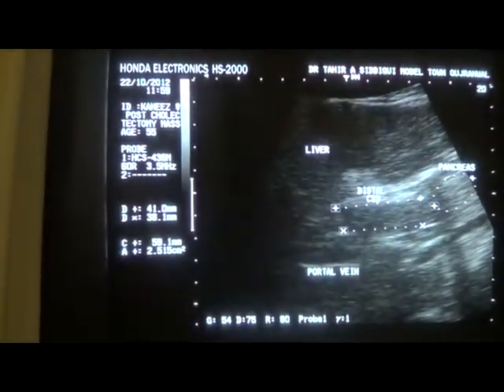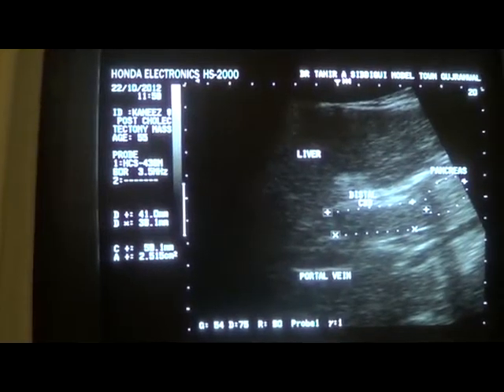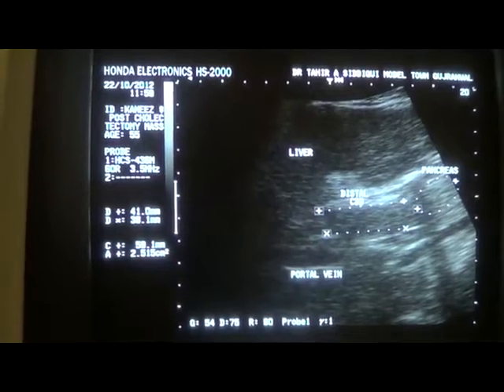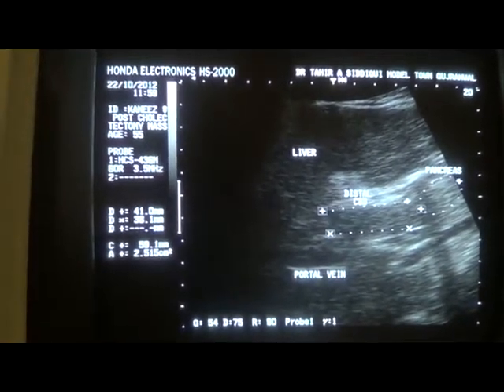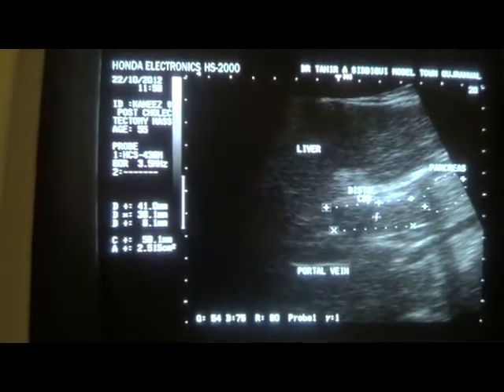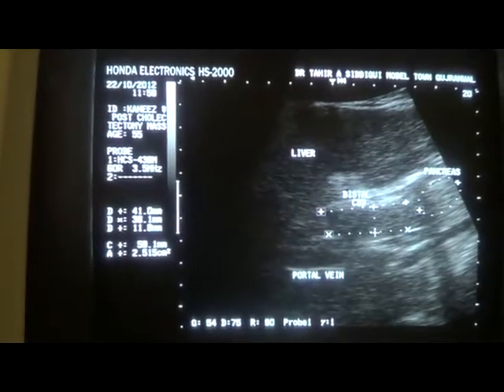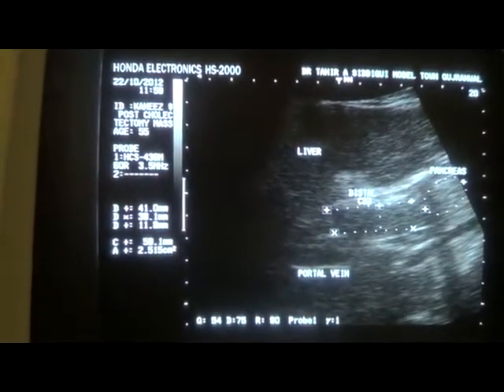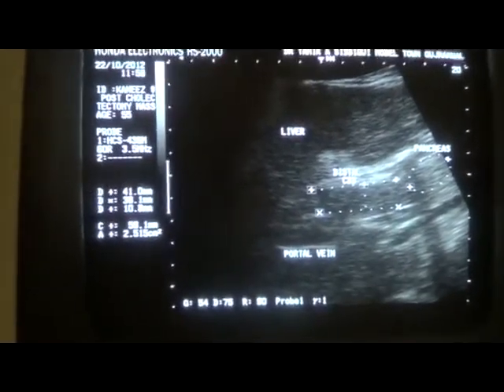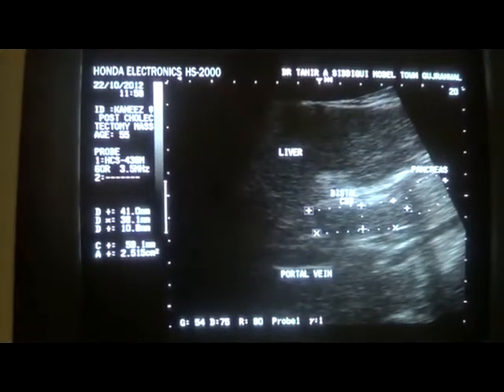So in this patient we see two pathologies. One, two subcutaneous collections in the region of the hypochondrium extending posteriorly, consistent with abscesses, or simply, if you wish, it would be better to say collections with dense coarse echogenic material within it.